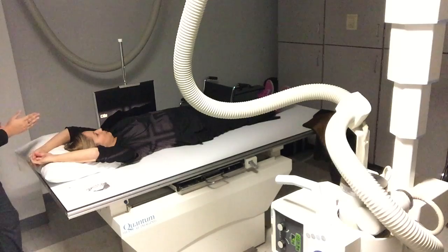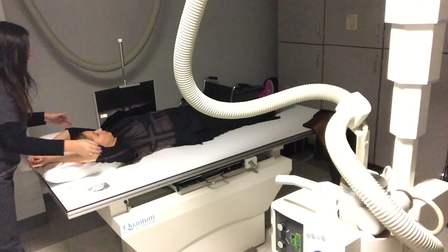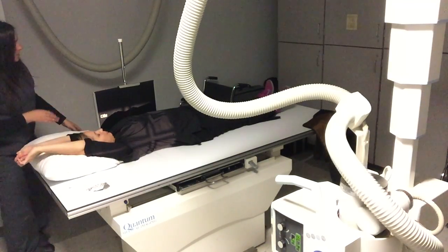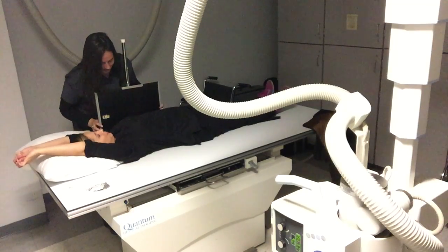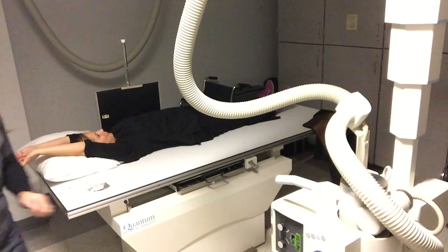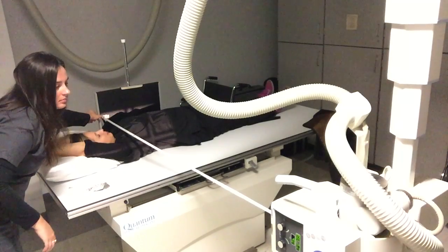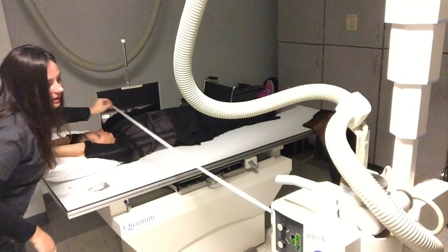For both of these projections you want your patient as close to the IR as possible to reduce your OID — object-to-image distance. I'm going to bring her elbows in a little bit closer and scoot the cassette closer to her on the side to minimize that distance.